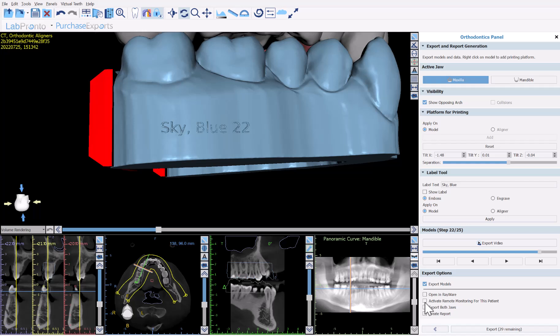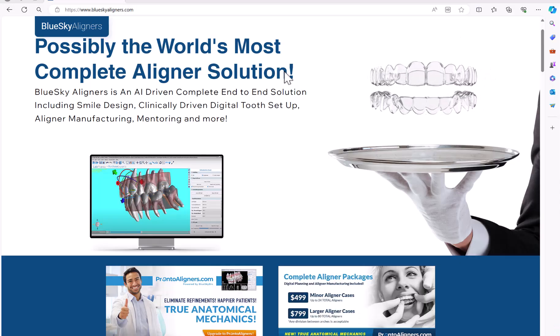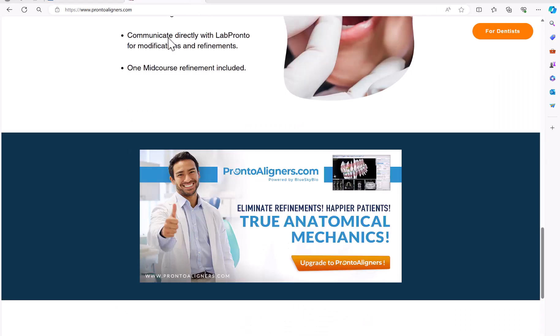Check blueskymonitoring.com for more information. We also have the option to export both jaws simultaneously — previously you would export one jaw at a time. You can also create a report by selecting relevant options and clicking export. The models and any designed aligners will be saved to your computer, and data will be sent to Blue Sky Monitoring if that checkbox is selected. Visit blueskyaligners.com for aligner solutions and prontoaligners.com to learn more about Pronto Aligners with true anatomical mechanics.